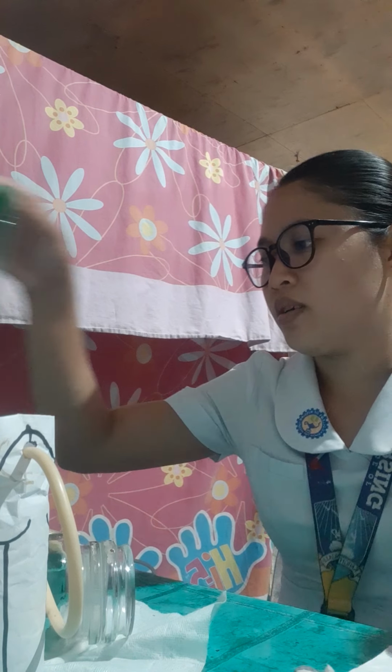Then, for assessment, first we are going to determine how long the catheter has been in place. Second, observe any discharge or incrustation around the urethral meatus. Assess for complaints of pain or discomfort. Then, next we're going to wash hands. Then, for planning, prepare materials and equipment needed. Then, for implementation, after washing hands, close curtains around the bed or close the door of the room if possible.